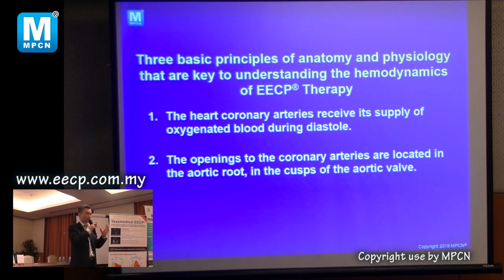So during diastole, when the heart is relaxing, your machine contracts and forces the blood out to the arteries. The function of a valve is to allow blood to flow in one direction. Any valve in a car, the oil must flow in one direction.